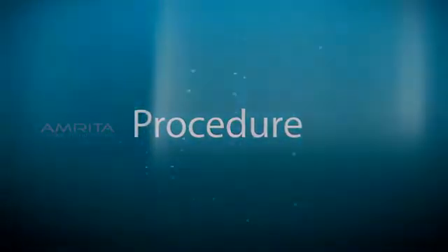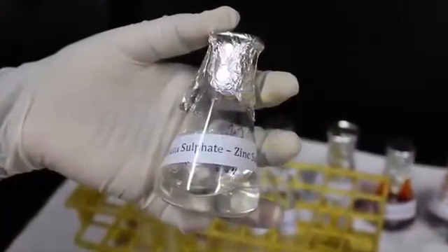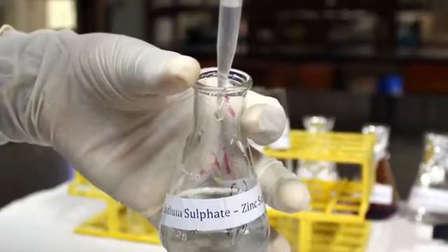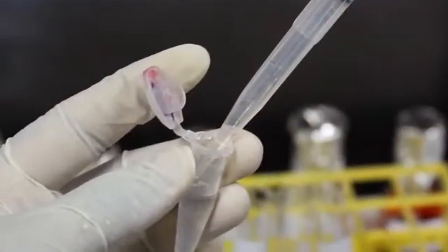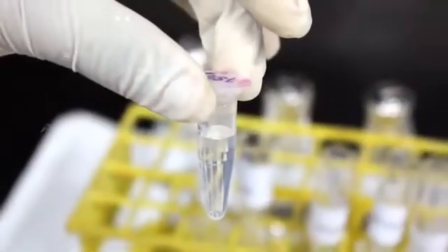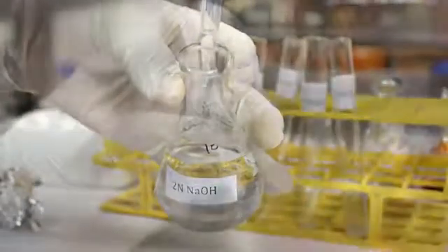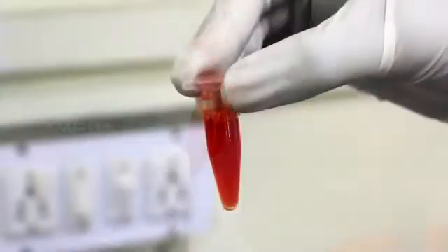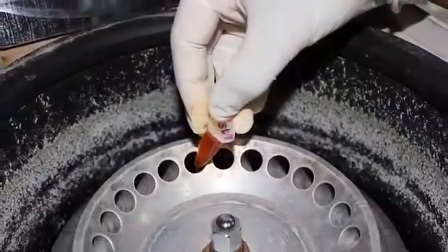Procedure: First, transfer 900 microliters of sodium sulfate zinc sulfate solution to a 1.5 ml microfuge tube, which is labeled as test. Likewise, transfer 50 microliters of 2 normal sodium hydroxide and 50 microliters of blood sample into the same microfuge tube. Now centrifuge the sample at 3000 rpm for 5 minutes.